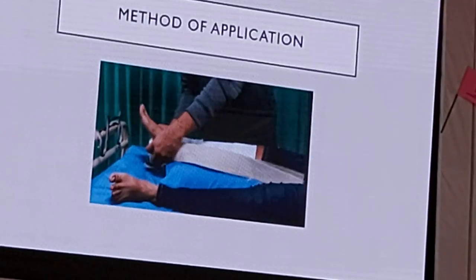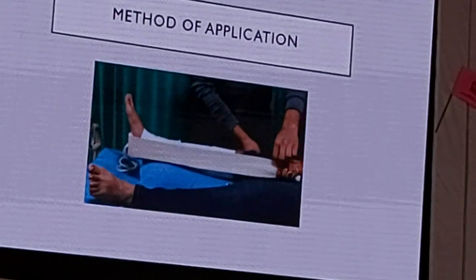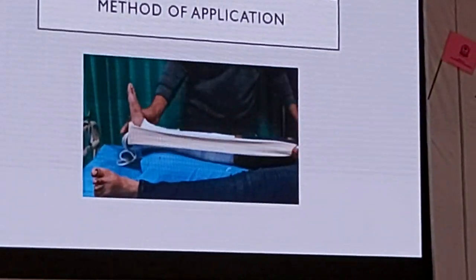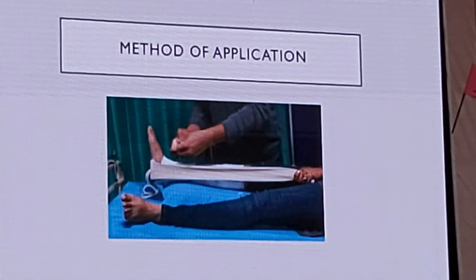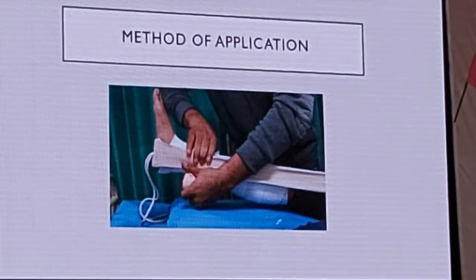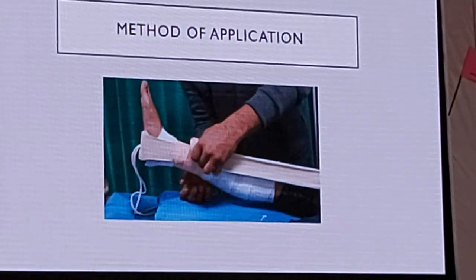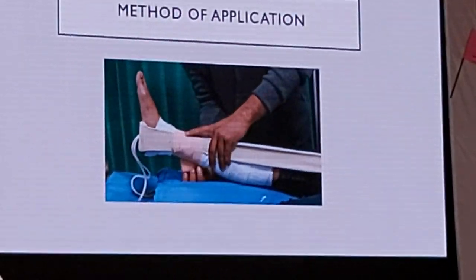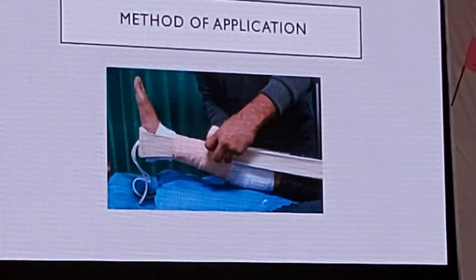Once you have applied the traction kit firmly, you will take a crepe bandage and cover the traction kit. Make sure that each rotation of the crepe bandage covers one-third of the previous rotation. Also, ensure that the pressure is not too much, as it can lead to neurovascular abnormalities or compartment syndrome.